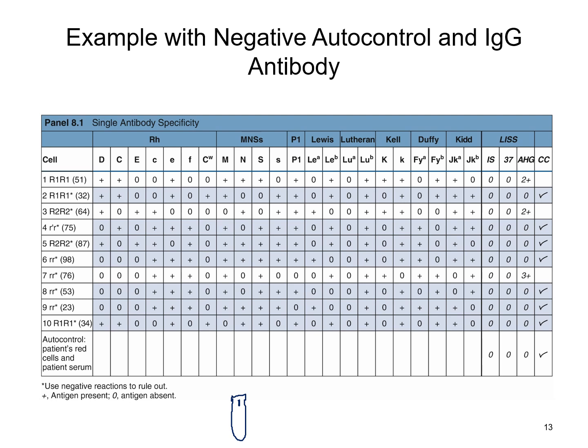And then to those tubes, of course, we added our patient's plasma, as well as one drop of red cells from that particular vial 1, added to that tube. Then we took that tube as well as all of those additional tubes, so we had a tube for each of these. We took them through all 3 phases of testing, and this was the reaction we got with this testing.